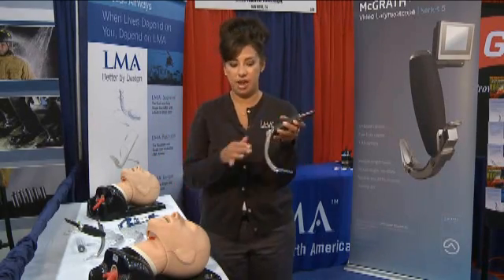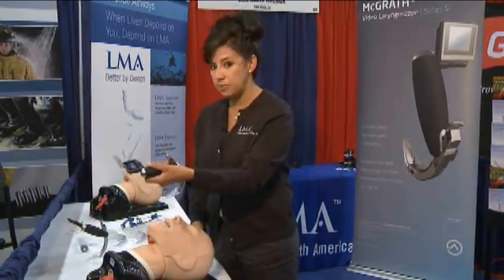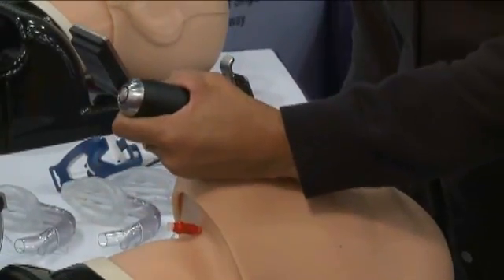I'm going to show you how it works now. You take your McGrath, you don't sweep the tongue, you don't have to extend the head or the neck at all. You go straight in midline, all the while watching your screen.